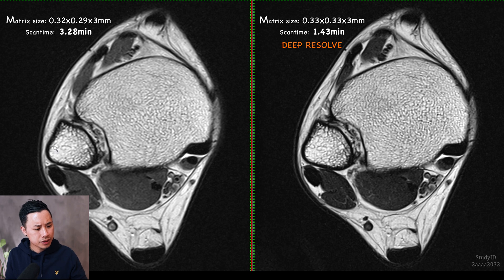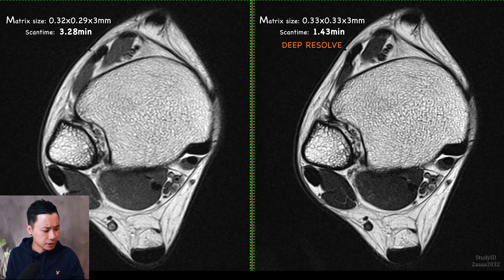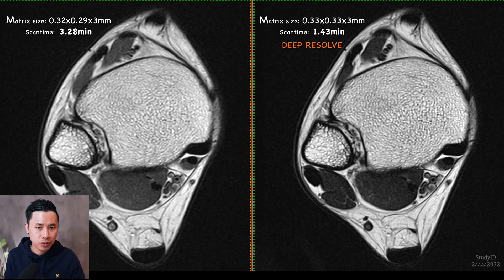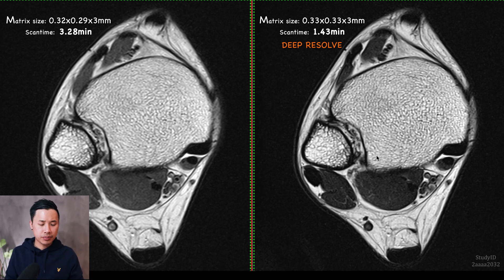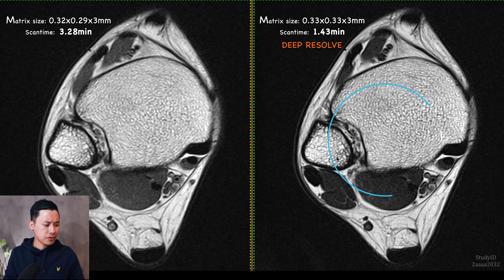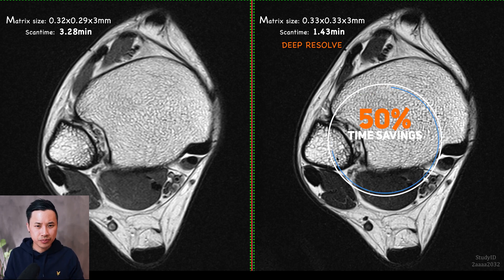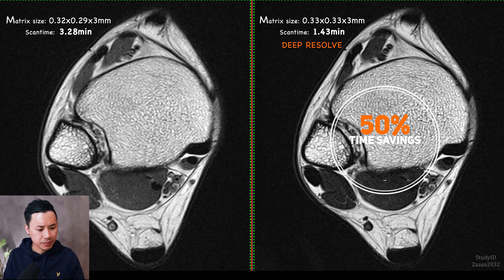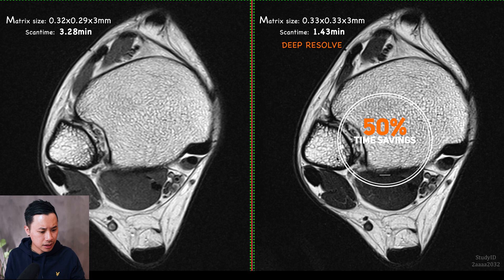The left one you see right here has a higher resolution and the scan time is around 3 minutes and 28 seconds. On the right side, DeepResult is applied and it takes around 1 minute and 43 seconds. So you save around 50% of scan time with these settings.